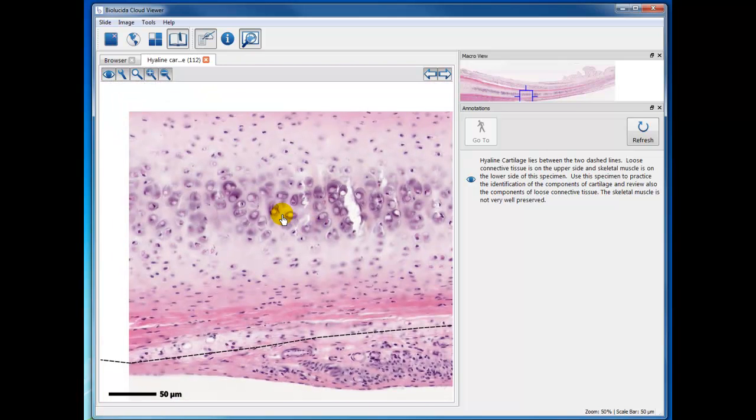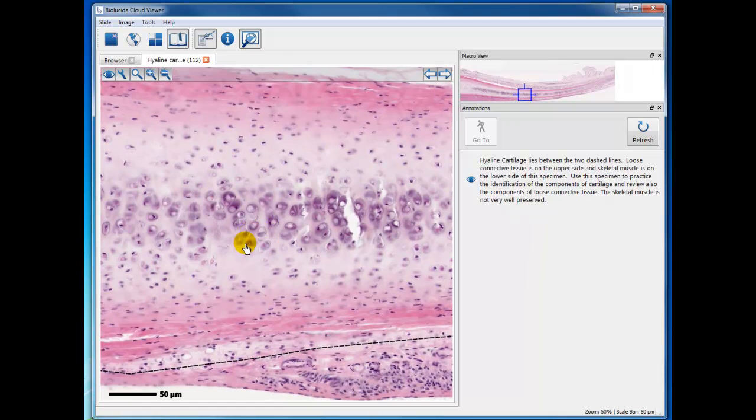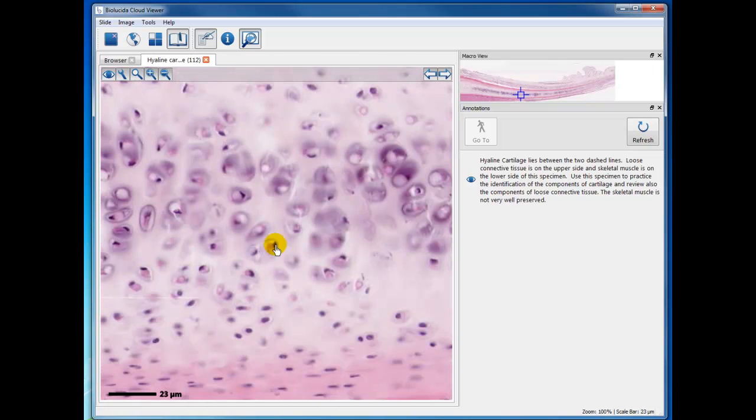And remember that cartilage can grow by mitosis on the periphery. That's appositional growth. And these cells here can still divide. And you see there is a little collection, an isogenous group here, these 3 cells or 4 cells. Any cells in the isogenous group would come from one chondroblast that divided a couple, 3 times.